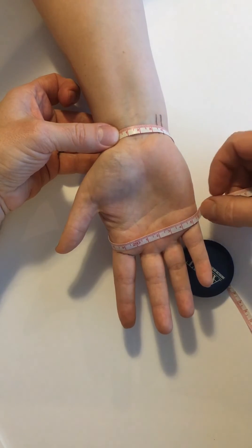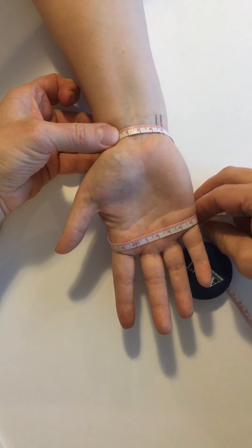We're going to bring this across the palm to the small finger palmer digital crease then.